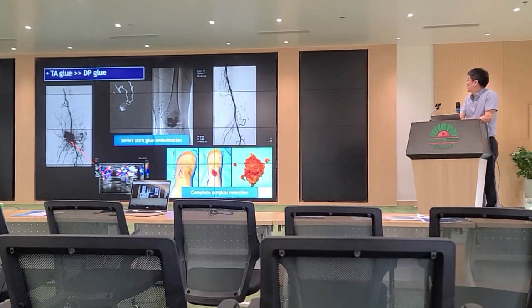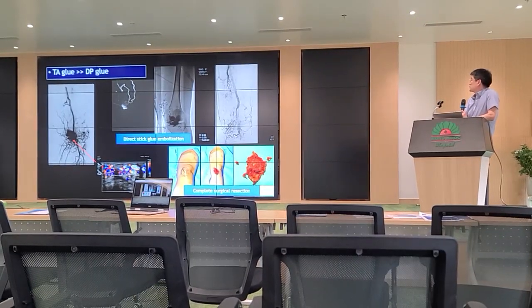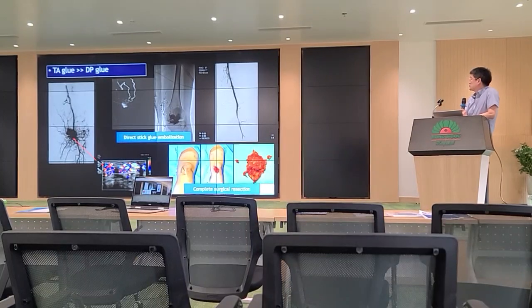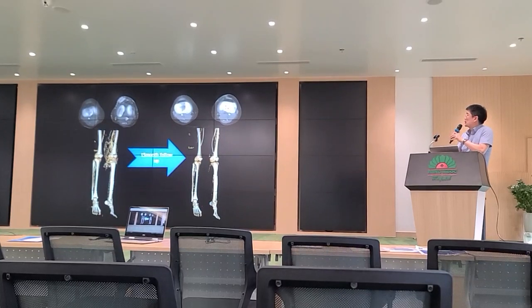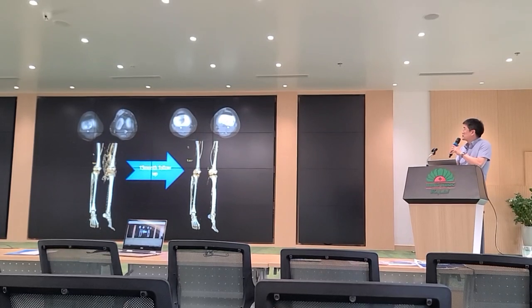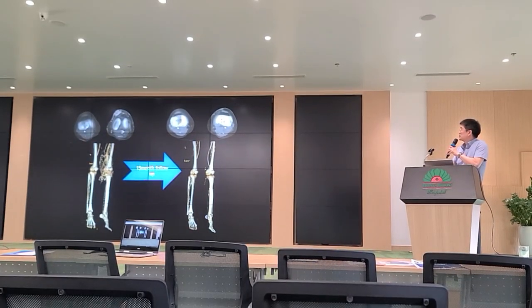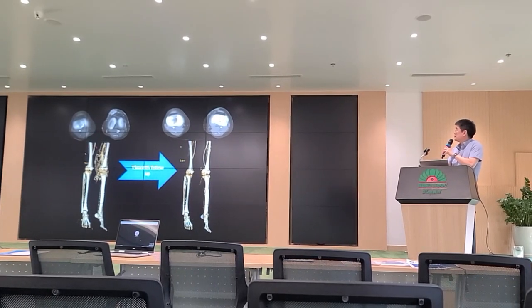Ở đây thì ông ấy chọc kim trực tiếp vào cái ổ, vào cái tĩnh mạch giãn và bơm thuốc phản quang lên, nó hiện hình cái tĩnh mạch đến, động mạch đến. Thì tôi có hỏi là bây giờ làm nào để mà tránh được là cái keo nó trào vào động mạch, xong nó đi vào động mạch khoeo thì nó tắc mất động mạch khoeo. Thì ông ấy bảo là phải dùng kinh nghiệm thôi, chụp đi chụp lại rất là nhiều lần, sau đó là mình sẽ biết được cái lực bơm như thế nào, thể tích bơm bao nhiêu thì mình mới quyết định là mình bơm. Vì trong quá trình bơm keo nó diễn ra rất là nhanh, nếu mà bơm non quá thì còn lại dị dạng, mà nếu bơm căng quá thì nó lại vào mất cái động mạch lành, cho nên là cũng phải rất là khó trong trường hợp này.